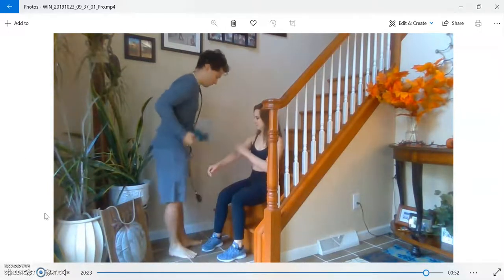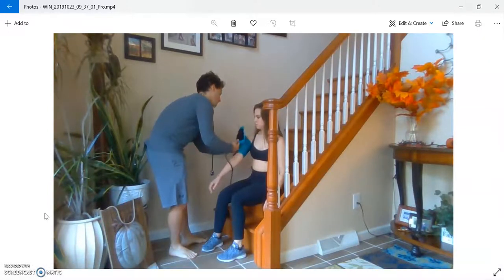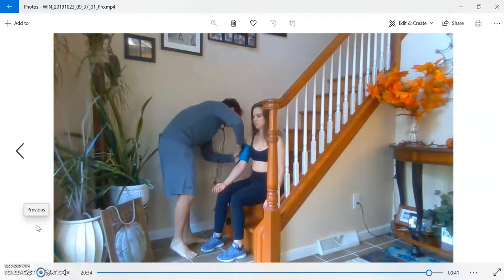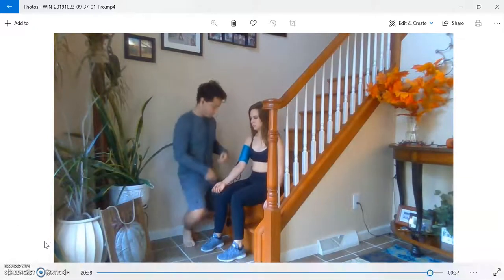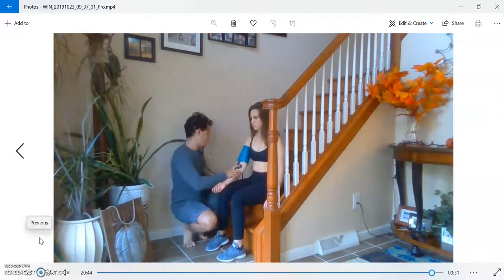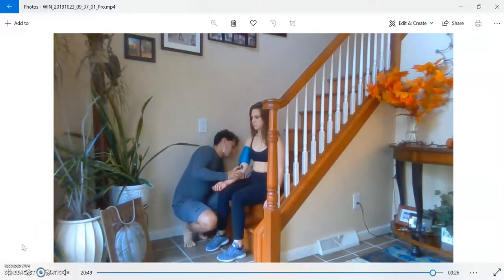At the end of the test, I once again take the blood pressure of the client to see how it has improved and increased throughout the process. By getting the blood pressure cuff on and getting right in the crest of the elbow, we once again take the blood pressure of the client and record the result at the end of all the tests.